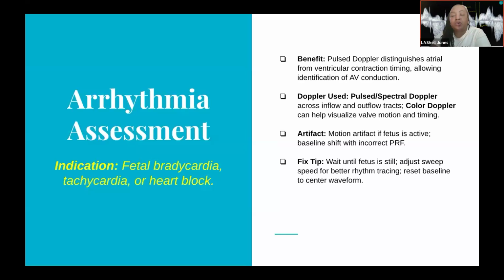Pulse and spectral Doppler will show the inflow, outflows. Color Doppler will help visualize the motion of the valves and the timing. Now, of course, we have artifact with this one in particular, especially if baby is very active. If baby's moving around, it can really cause some artifact. A quick fix, wait until the fetus is still, adjust your sweep speed for better rhythm tracing, and reset that baseline, okay, to center that waveform.